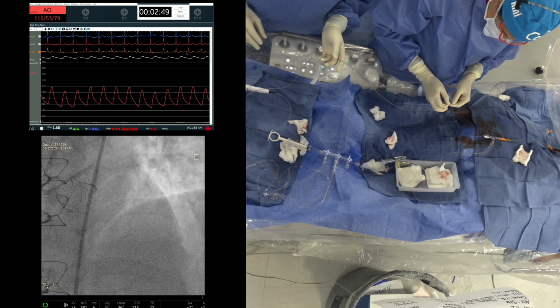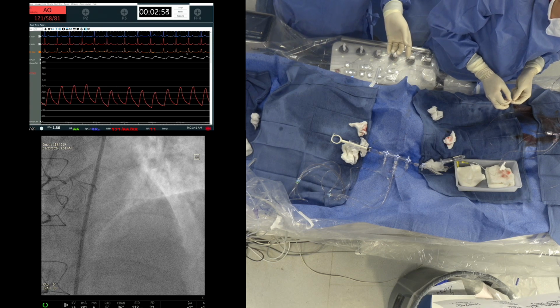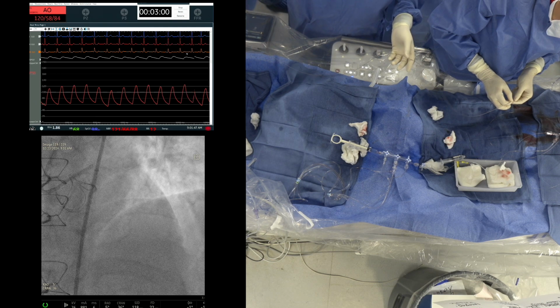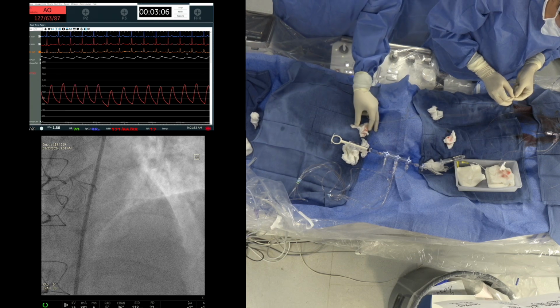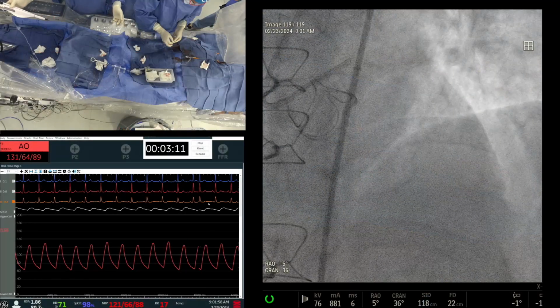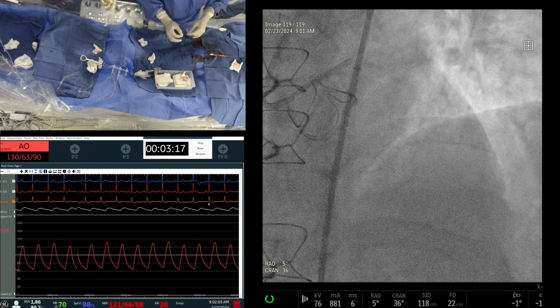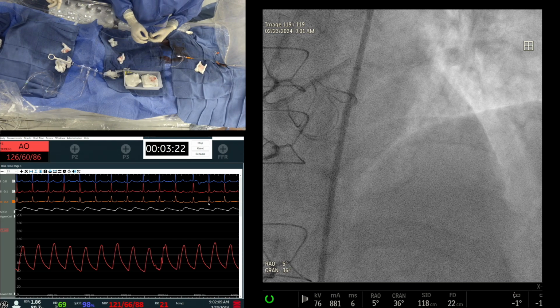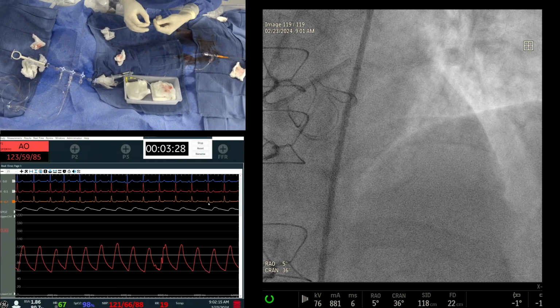Yes. Because I've gone through your RotaCut article. You have mentioned that there is not much difference between the cutting balloon and this non-compliant high pressure balloon. Yeah, that is correct. In terms of the primary endpoint, the minimum stent area expansion is identical with the two approaches. In osteal lesions, because there were only 60 patients and osteal lesions were a little less, I would just favor the cutting balloon. Otherwise, the high pressure balloon is good enough based on the RotaCut trial.